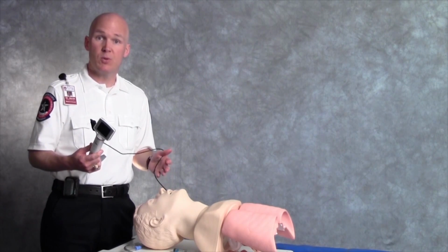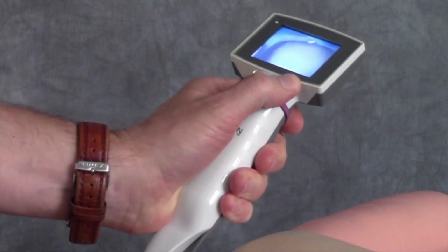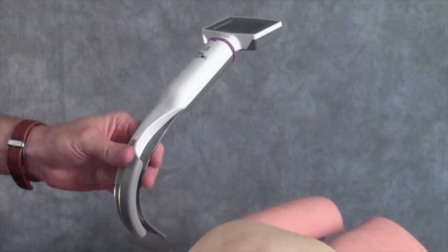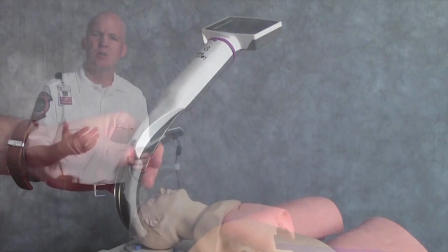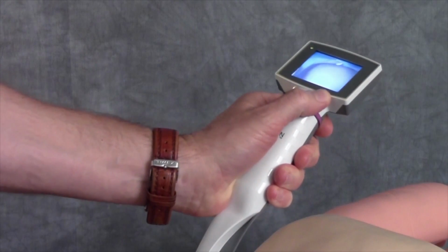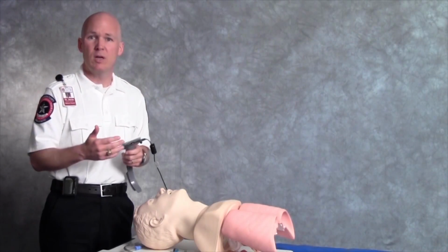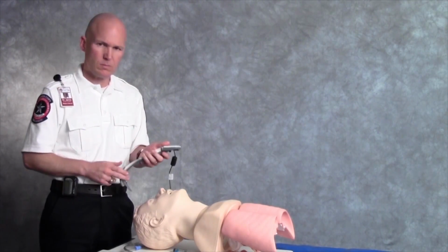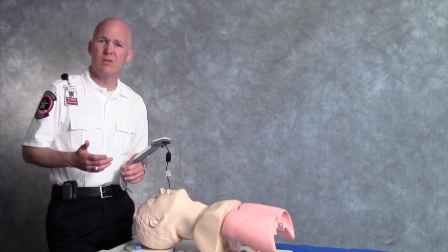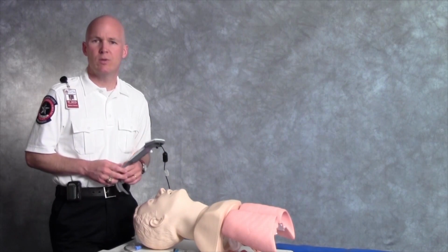So the biggest difference between how we teach this device and how other systems may use it is how we hold it. So rather than hold it up here using this very nicely designed handle, we have our medics hold it very lightly at the base, right where the channel joins the blade. There are two reasons for this. First, we found that when we held the device high up on the blade, right up on the handle, it was relatively easy for us to accidentally dislodge the head of the device, and that would cause a loss of video signal. So holding it low keeps our hands far away from the head and prevents this dislodgement. Although like other systems we did experience this problem of knocking the head off, we haven't had any further incidents since we changed how we hold the blade.